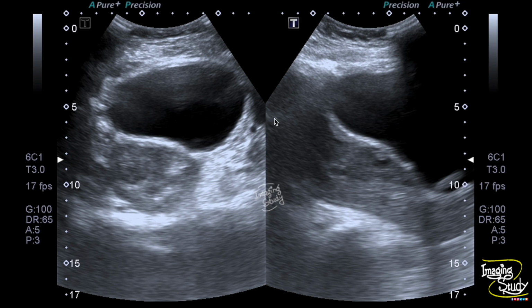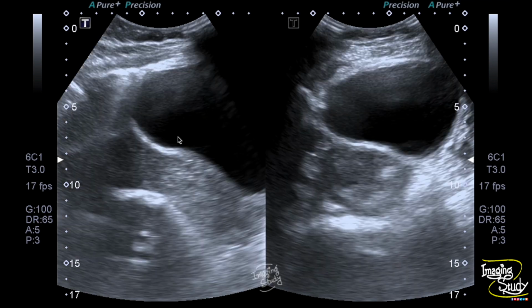Here's the picture of the uterus in longitudinal and transverse section. Can you detect the collection here? This irregular hypoechoic area communicating with the uterine myometrium with a gap here is the collection due to perforation. Let's check on the marking here. Here you can see the collection communicating with the myometrium with a defect in the perimetrium, which is shown here.